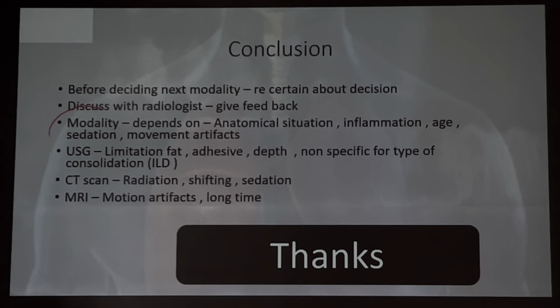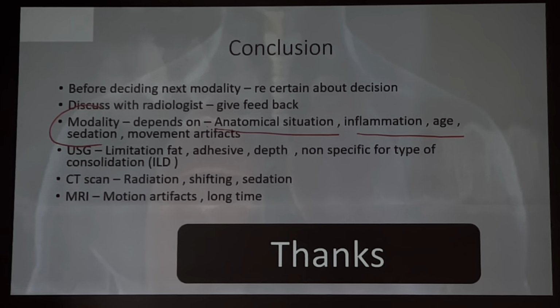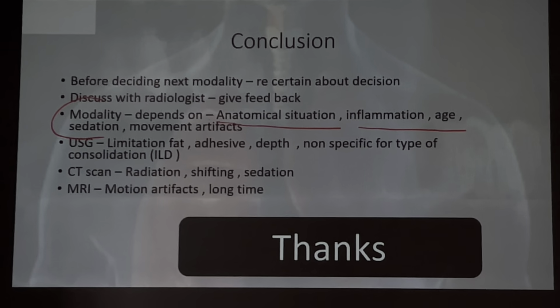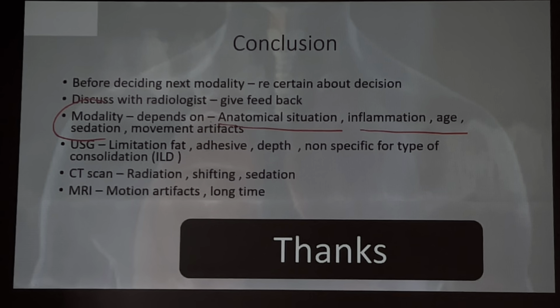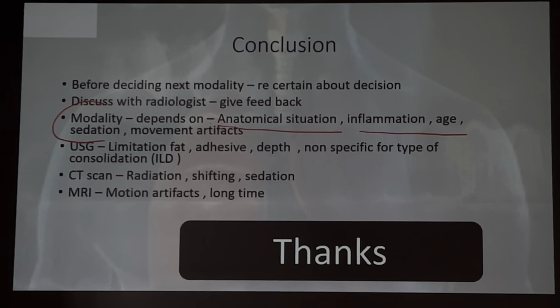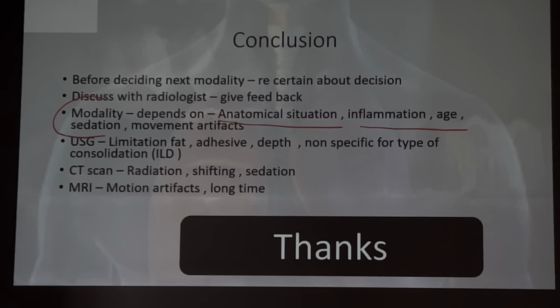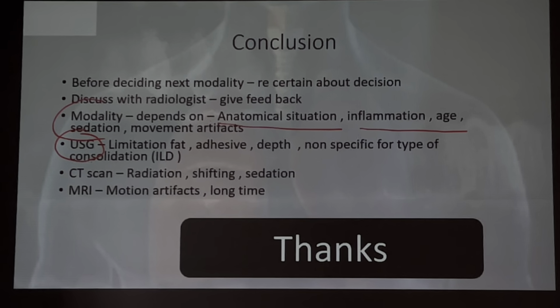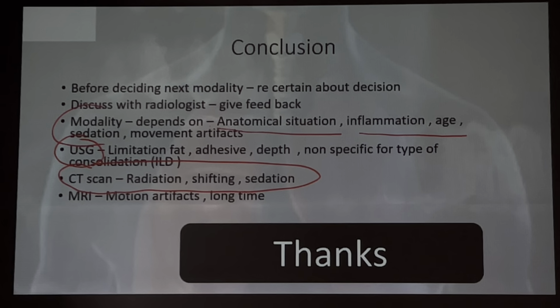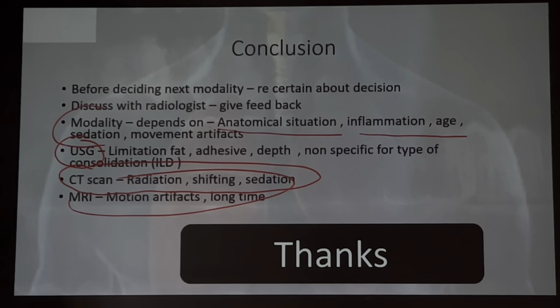And regarding modality, again it depends on the anatomical situation, image, whether you want to look at the inflammation, age group of that patient, whether sedation is required or not. Adults normally do CT scan very frequently, especially the elderly, but the pediatric age group is going to last for say another 70 years. If you expose them to radiation, it can be hazardous. And as I told you, ultrasound has its own limitations. CT scan has the major limitation in the form of radiation, shifting the patient and giving sedation. And of course, MRI has motion artifact and takes a long time. Thank you very much for the patient hearing.